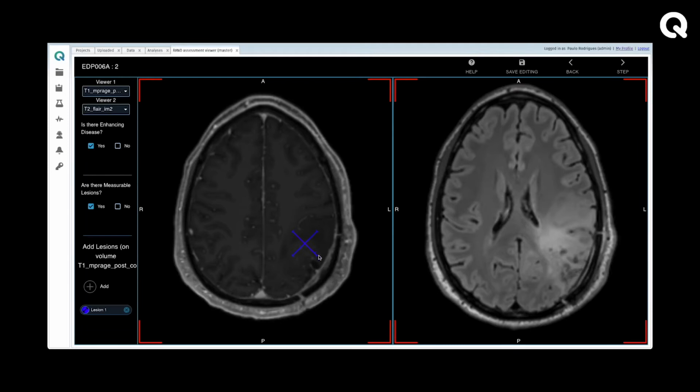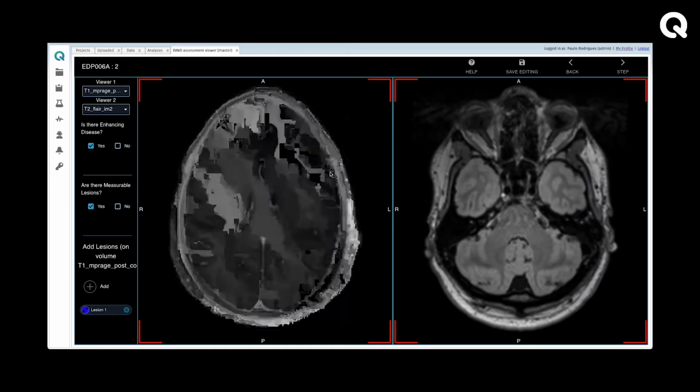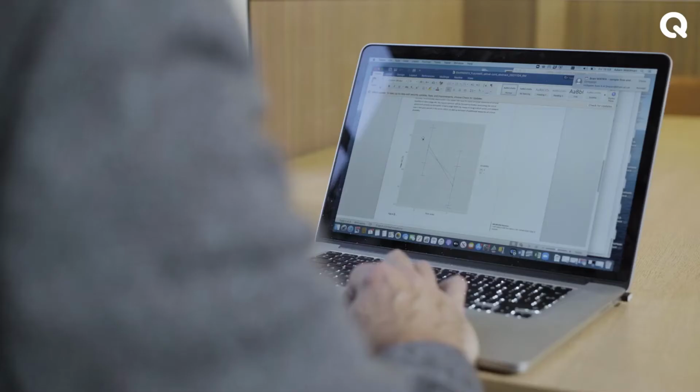The RANO tool that we have developed in collaboration with QMENTA allows cloud-based online RANO assessment performed by neuroradiologists with digital output which can then be downloaded to the centres at which the imaging has been acquired, but also archived centrally for further analysis. This will allow RANO evaluation for multi-centre trials and provide an important platform for treatment evaluation in that context.